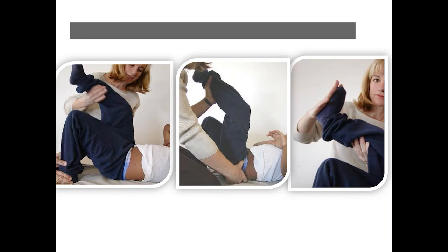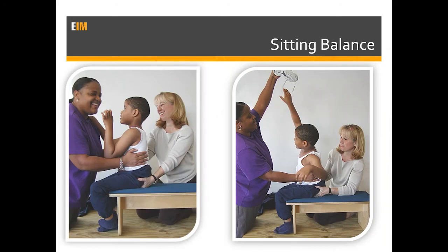Okay, very quickly we can scan. Make sure, just capture that you're not getting any movement to that pelvis. Especially with him, he had such an obliquity and a scoliosis. He's going to have a tendency to sort of rotate away from those corrections, just because his muscles and his body segments have gotten used to sitting like that. And then we'll move into the sitting assessment.